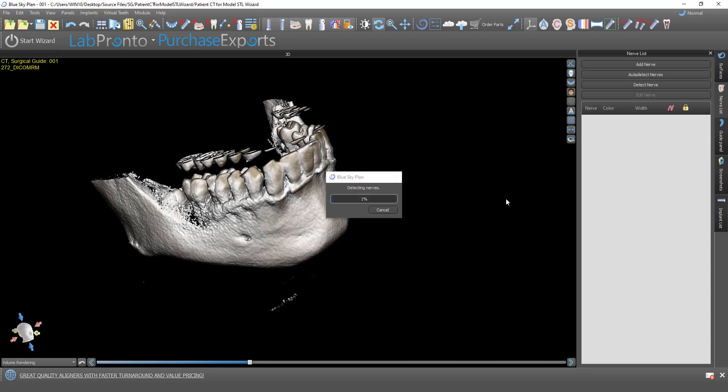So the fastest and easiest way, just click that Auto Detect Nerves, let the software do what the software does, and we'll go ahead and detect those nerves.